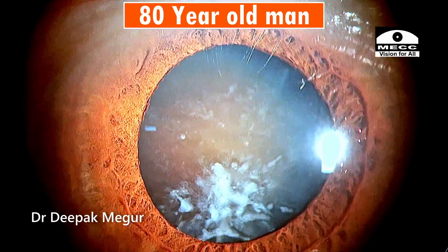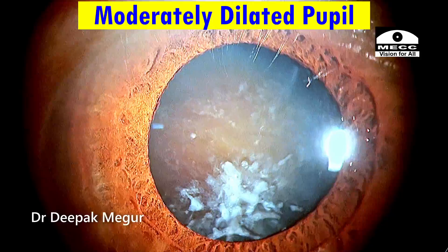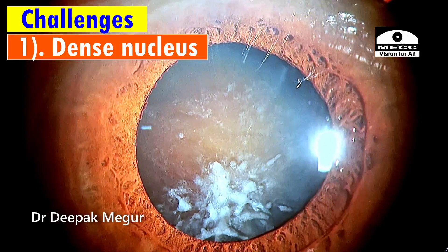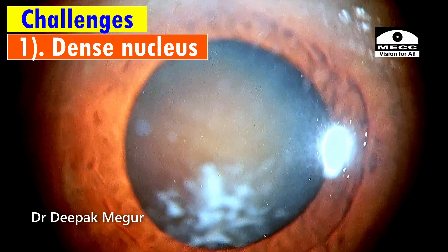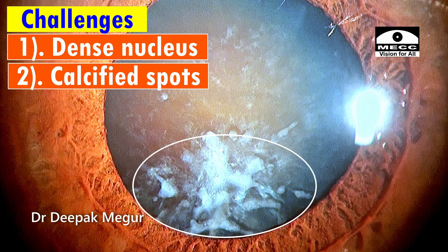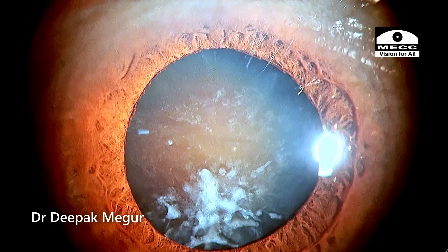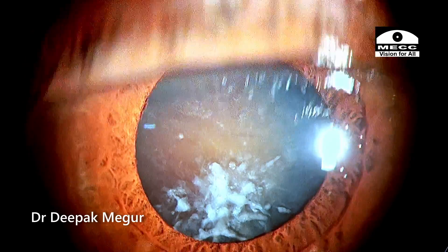He is an 80-year-old gentleman with a brown nuclear cataract and a pupil which is moderately dilating. The nucleus is very dense, and that's the challenge while dealing with such cases. Apart from the dense nucleus, I'm concerned about these calcified specks which are slightly paracentral or near the equator of the capsule. This is cause for concern — I'm worried whether the capsulotomy will be intact and how to do the rhexis in such situations.